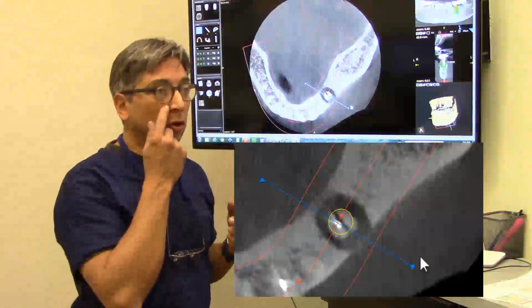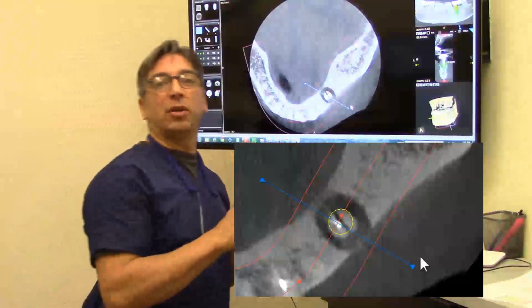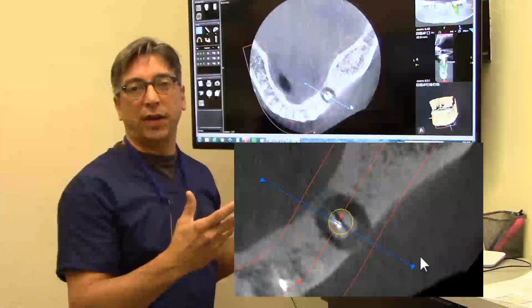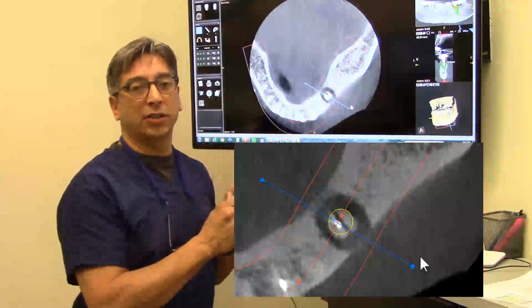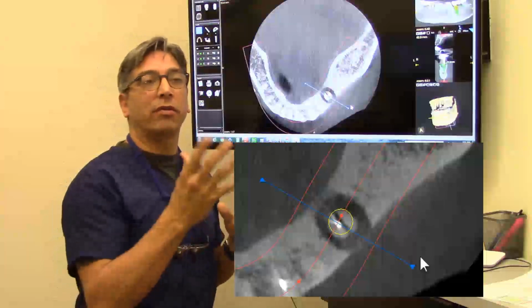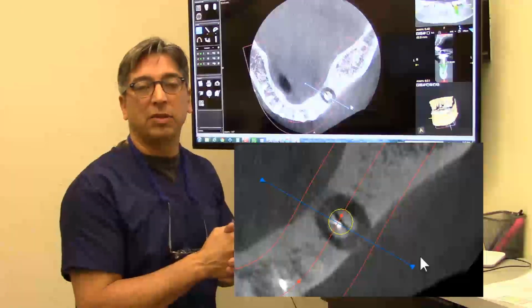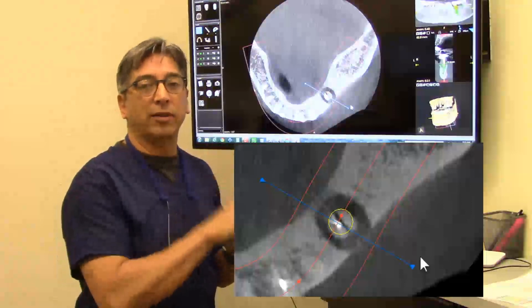I have talked to an oral surgeon. He says he's tried putting graft material into a D4 bone situation and tried to create an osteoinduction effect and create some density with that mineral. He believes it actually works out pretty well. So you could always try that. I would only recommend that possibly in the upper arch, maybe some areas on the bottom from time to time. But you really got to make sure you keep the sterility very high if you start doing something in that nature.